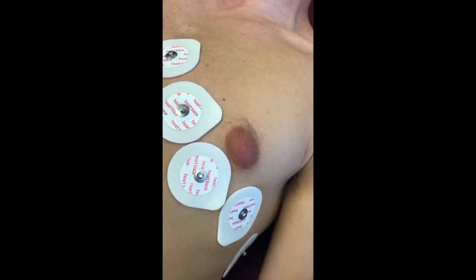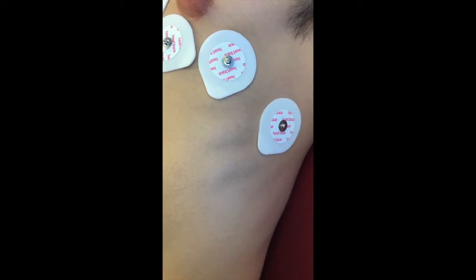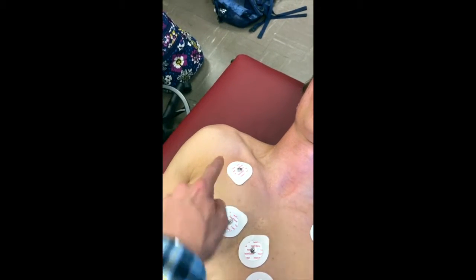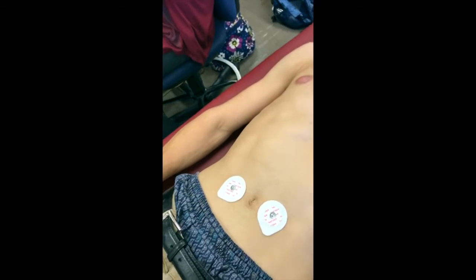V5 is horizontally adjacent to V4 at the anterior axillary line. V6 is horizontally adjacent to V5 at the mid-axillary line. The four limb leads are right arm, left arm, right leg, and left leg. The right leg is the ground.